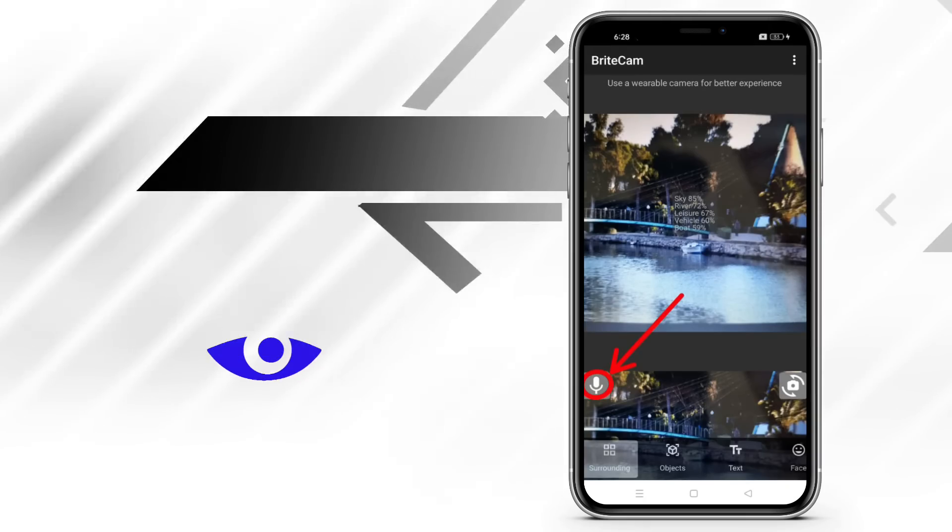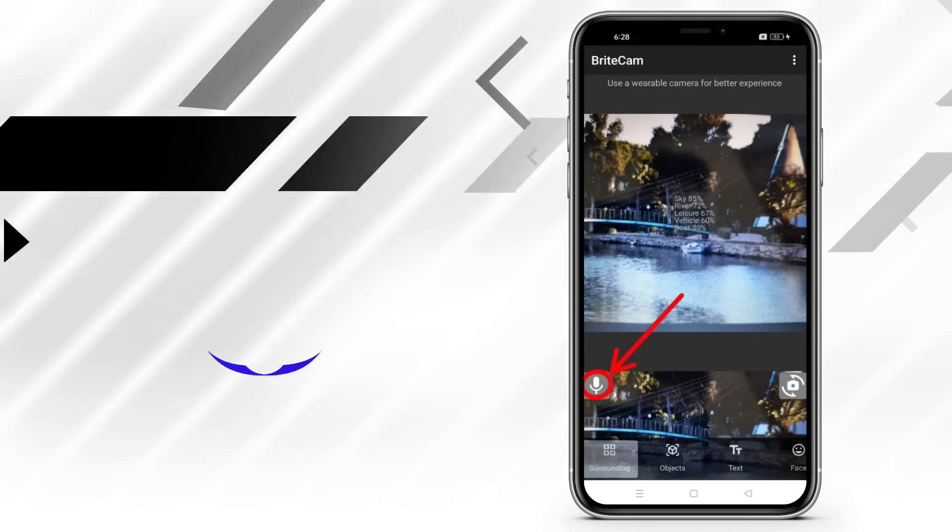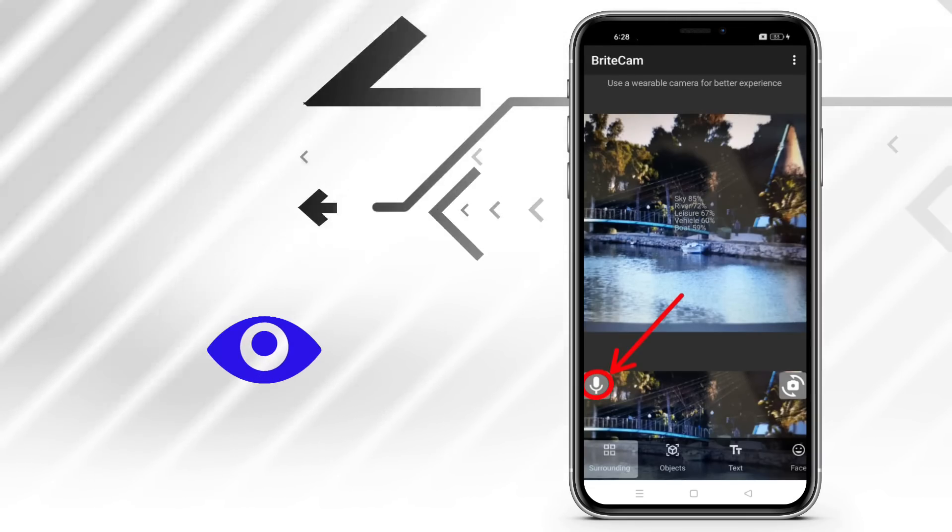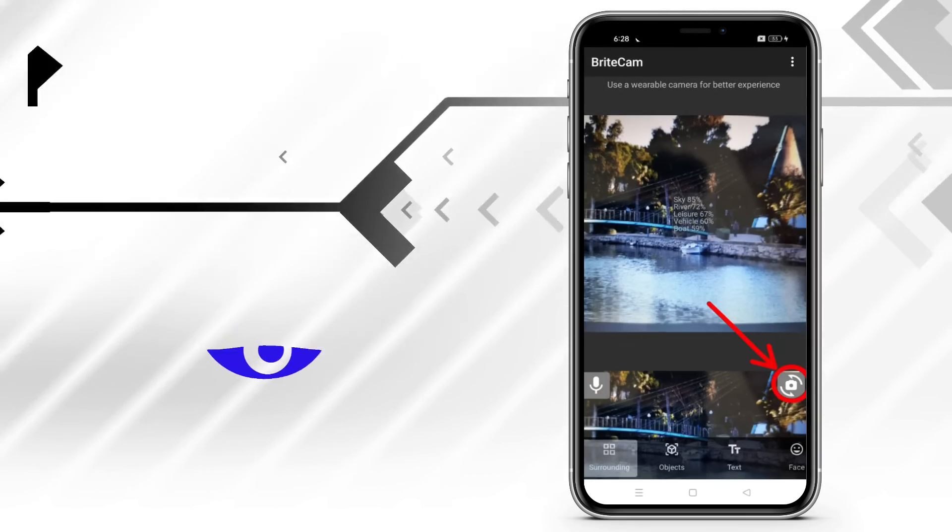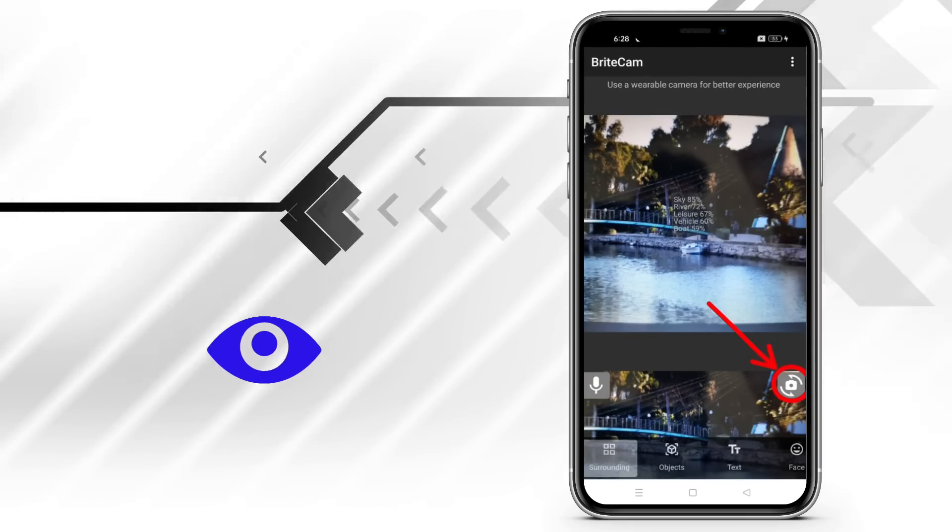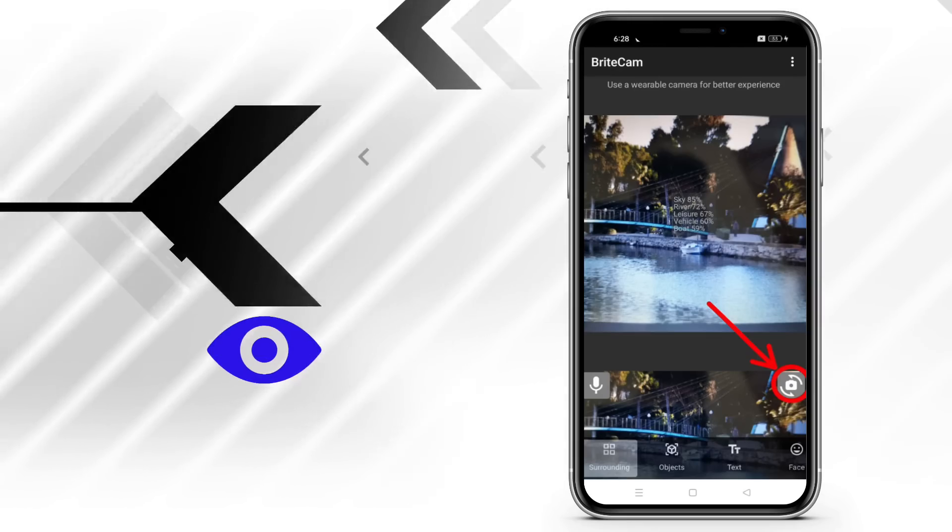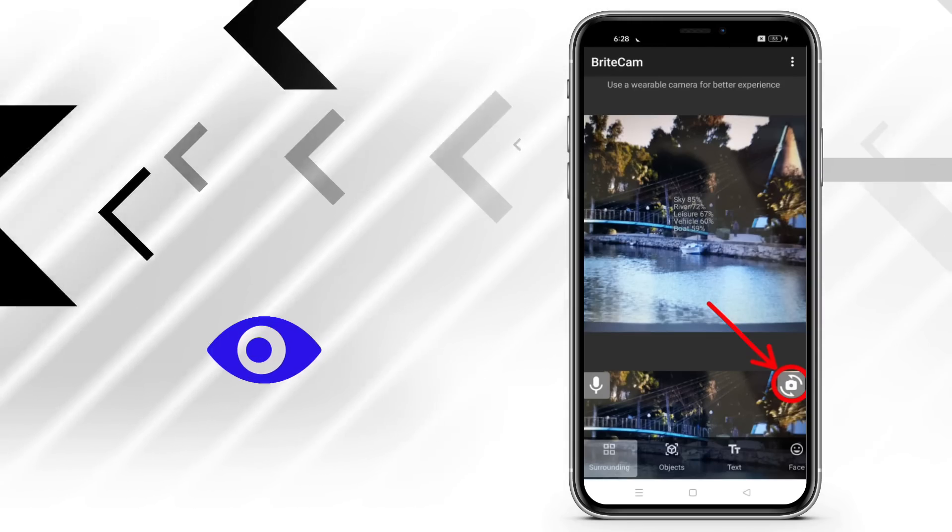The voice control will listen to and respond to the user's voice commands. The switch camera will switch between the phone's camera and the wearable camera.